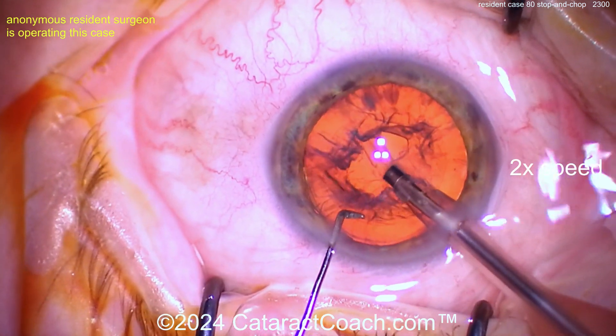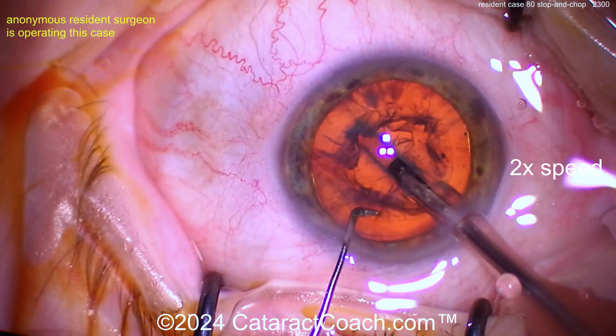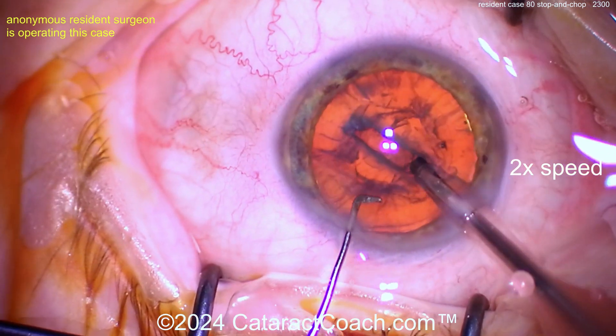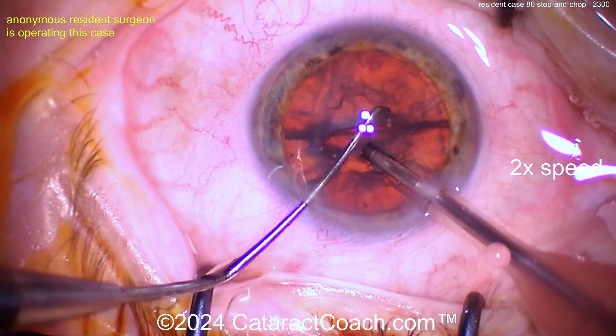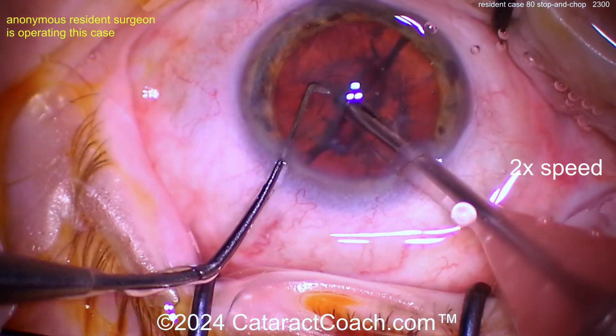Here comes the groove. I like how it started just inside the sub-incisional rhexis. The passes are pretty good — remember: deeper in the center, a little shallow towards the periphery. That's pretty good. You may want to widen up or maybe just crack it already. Wow, that's pretty good — very nicely done. Good rotating of the nucleus.